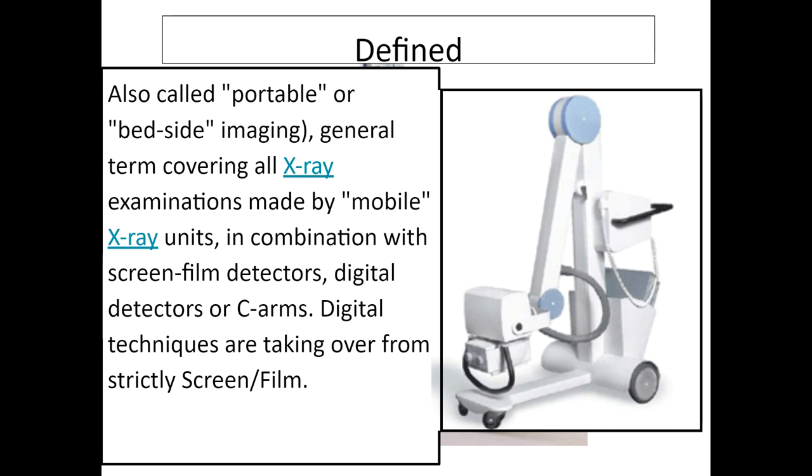So occasionally you had to find, literally, a linen closet or a bathroom. You'd throw your jacket off, close the lights in the bathroom, throw it on the floor against the door to keep the light from getting in, change your film so that now your cassettes are fresh again, and repeat. It was pretty horrible. I didn't have a route either, so I just went from the Bronx to Far Rockaway to wherever.